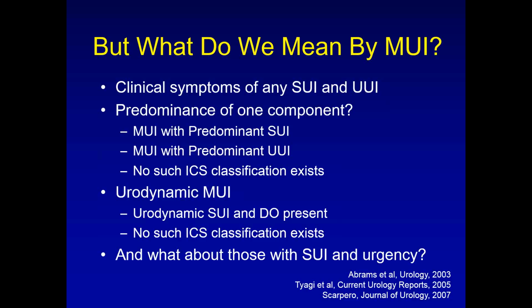And the same often is true for stress incontinence. So it's a dynamic problem, and sometimes patients will not leak in front of you even though they swear they have leakage when they cough and sneeze. Sometimes they're embarrassed. Sometimes the urethral catheter's causing irritation or spasms of the urethra, so they won't leak there either. So urodynamic classifications for mixed incontinence is, I guess, nebulous is the best terminology I would use, because just because you don't see it on a urodynamic study doesn't mean it's not there.